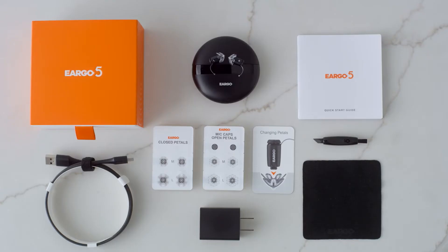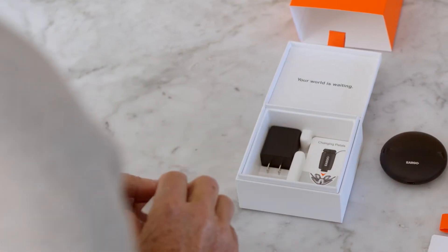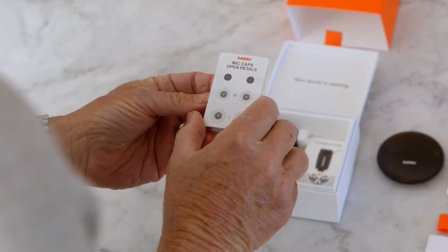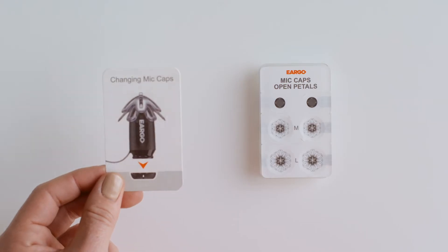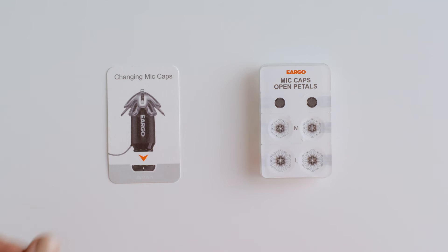Eargo's accessory packaging is designed to help you change mic caps easily. You'll find extra mic caps inside the base of the box, packaged with extra open petals. Locate the tray and place it label side up on a flat, well-lit surface.